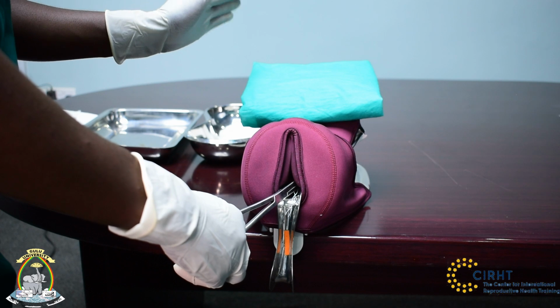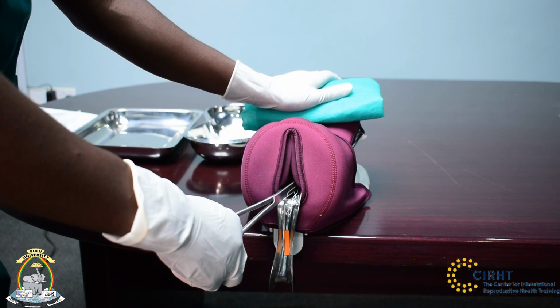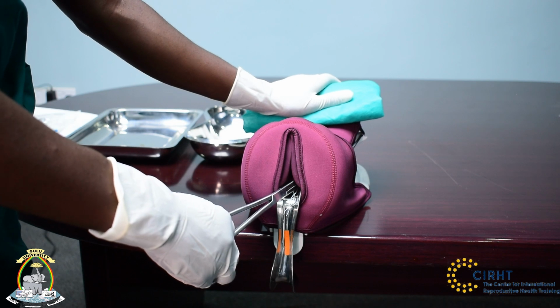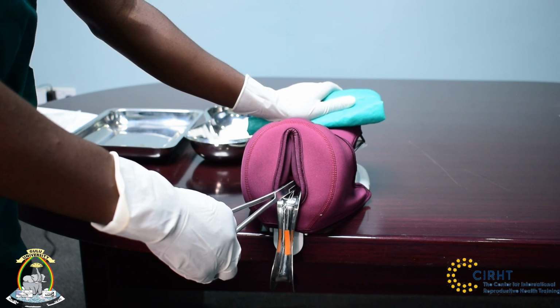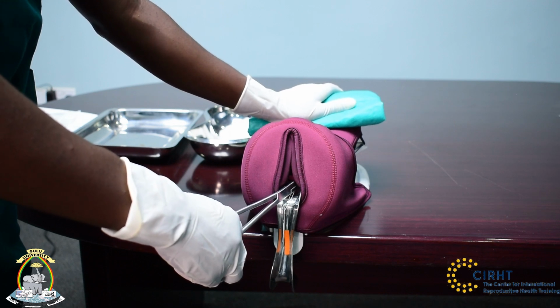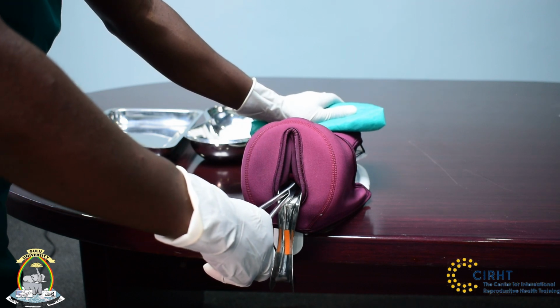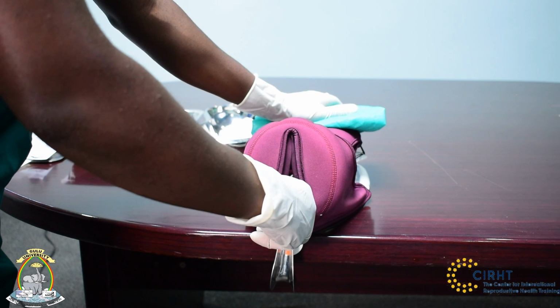So by elevating, we mean placing that less dominant hand at the base of the lower part of the uterus. That is just above the pubic bone, with our fingers facing towards the fundus. And then we will gently push the uterus upwards in the abdomen so we can extend the lower uterine segment and reduce the vaginal uterine angle. So when we do that, we can now gently progress with our IUD. So we will progress with our IUD until we feel resistance again.